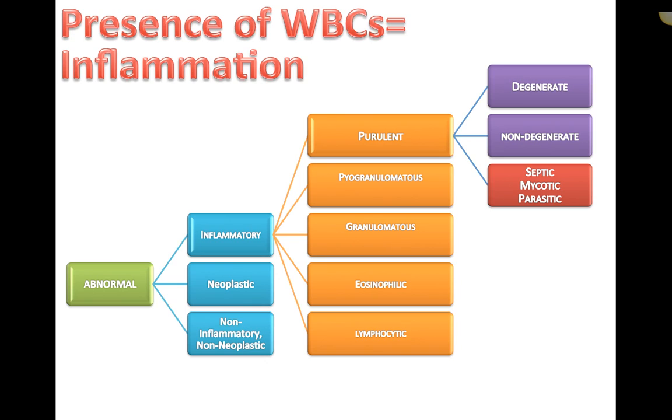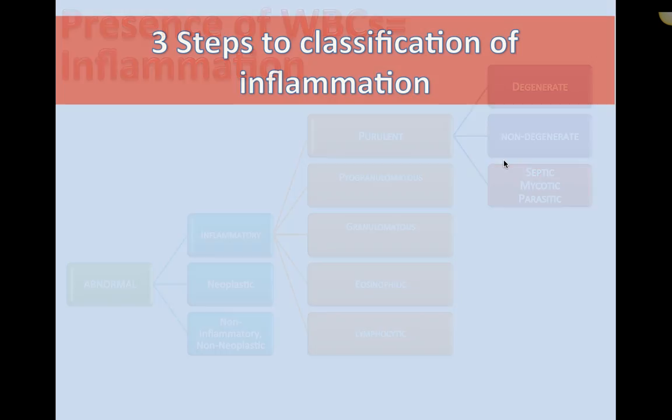And lymphocytic is also often called lymphocytic plasmacytic, and that's because of the presence of plasma cells, which you typically see together, especially with reactive inflammation, reactive lymphocytes. So we'll go through each specific category in detail, and then just note this chart, I also want you to take these subclassifications and also attach them to Pyogranulomatous. Okay, not only purulent but Pyogranulomatous as well.